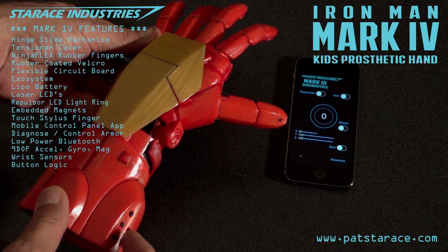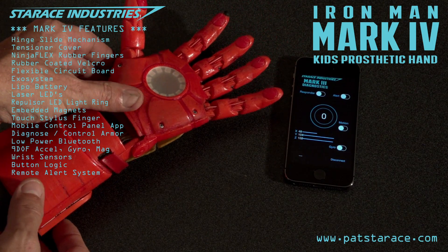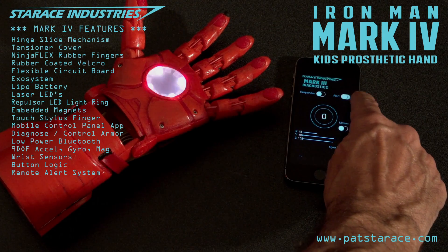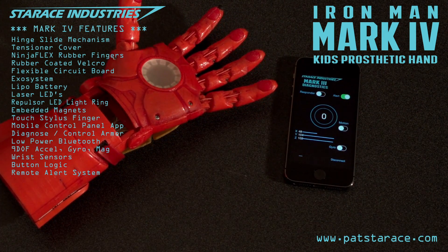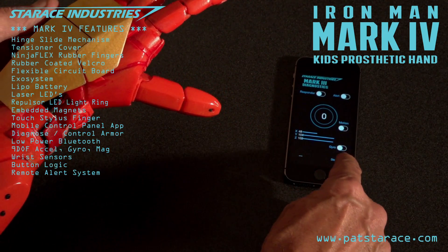Sir, I thought you'd like a remote alert system as well. It activates the repulsor and vibrates the armor with haptic feedback. Just press the alert button. This is so cool. Great job. Thank you sir. And you'll never be late for dinner. Very funny.